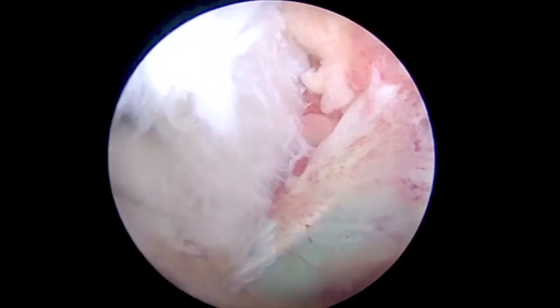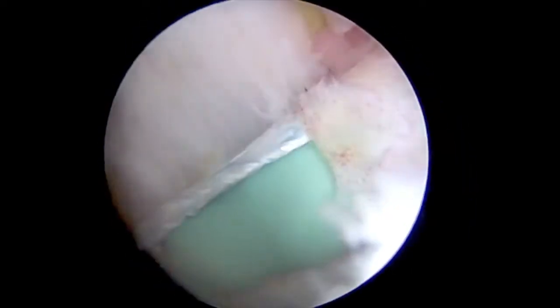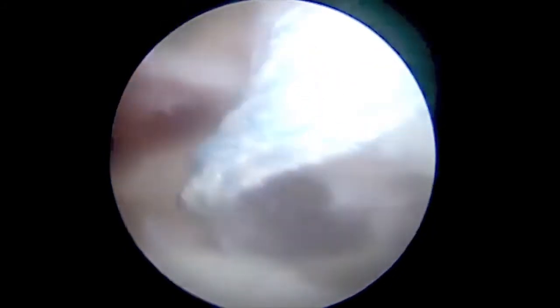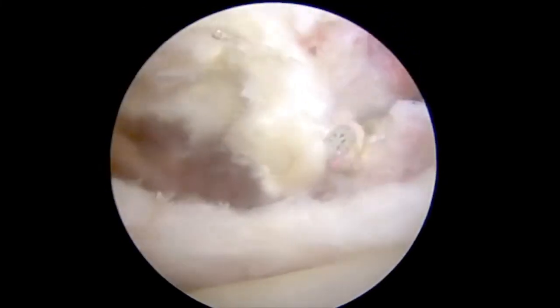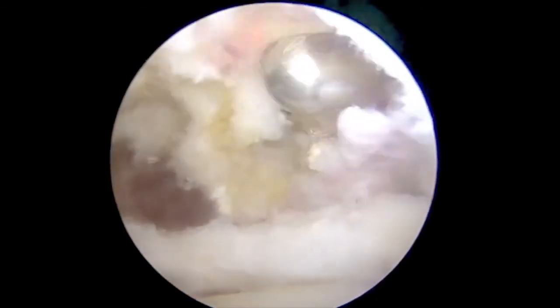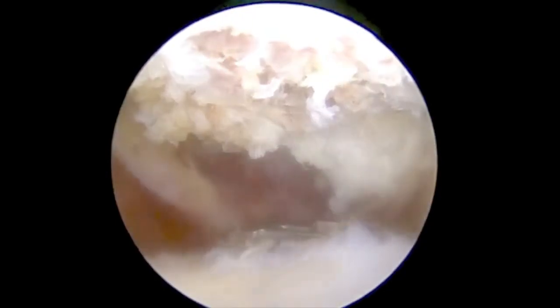The first anchor, a 4.75mm swivel lock loaded with fiber tape, is placed at the inframedial aspect of the subscapularis tear. The surgeon should be sure to leave enough space to grab tissue once the suture is passed. The suture is passed through the torn subscapularis tendon with a horizontal technique using a fast-pass scorpion suture passer through the anterior portal.